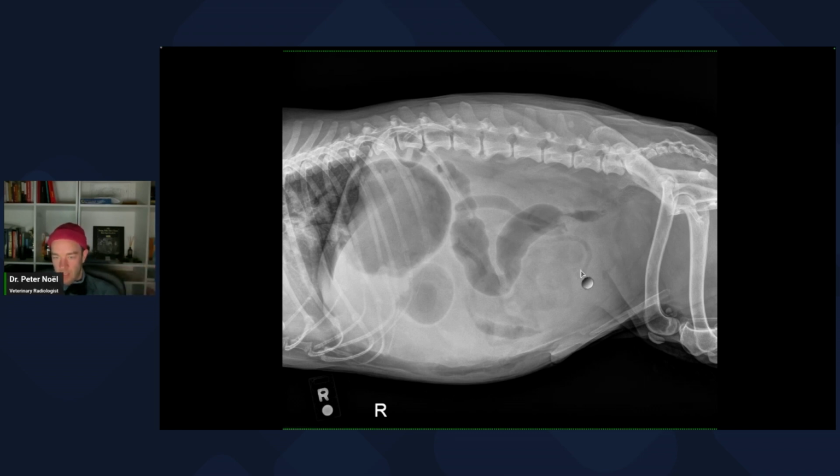Does the dog have cardiac tamponade? There was a report that I talked about not too long ago. Classically we think dogs with pericardial effusion have to have a globoid cardiac silhouette, but that's not true. It depends on the volume of effusion and the chronicity. If you have a decent volume over time, it will stretch the pericardium. If you have a clinically relevant volume that happens acutely and the pericardium hasn't had enough time to stretch, you're not going to have a globoid heart.